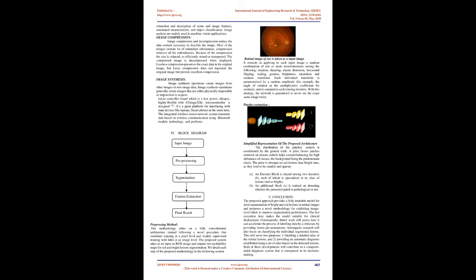The next step is the pre-processing step where the image is improved before being fed as an input to the other processes. Pre-processing typically deals with enhancing, removing noise, isolating regions, etc. Segmentation partitions an image into its constituent parts or objects. The output of segmentation is usually raw pixel data, which consists of either the boundary of the region or the pixels in the region themselves.